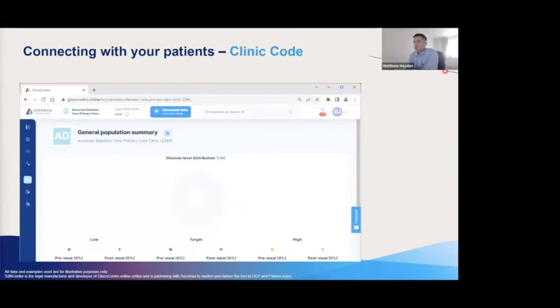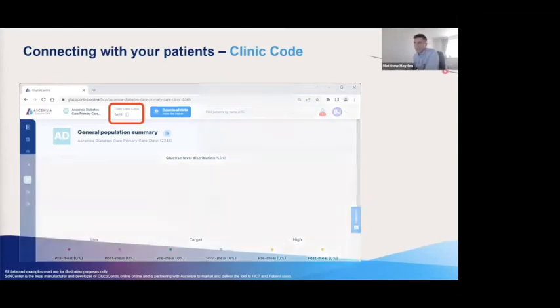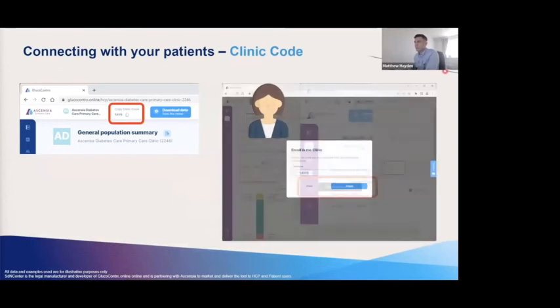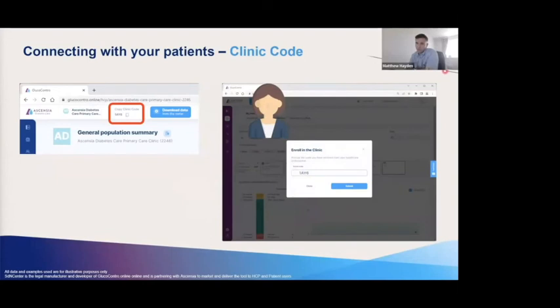In the fourth and final option we look at the clinic code, using the example of Fiona. Fiona would like to use GlucoContro Online but prefers to do it later. You would give Fiona your unique four-digit clinic code, which can be found at the top of the menu bar. Once she creates a GlucoContro account, Fiona can request to join your clinic by clicking enrol in clinic in the left-hand menu bar and inputting the unique four-digit code that matches your clinic specifically. You as a healthcare professional will then receive a notification that Fiona has asked to join your clinic and share her blood glucose data, and you can either approve or reject her request.